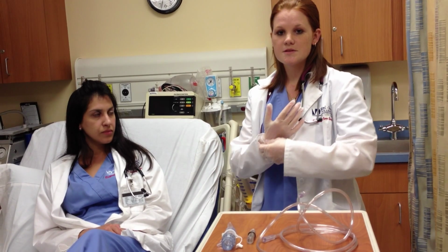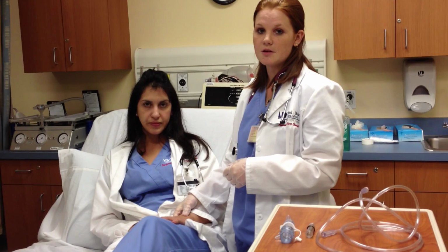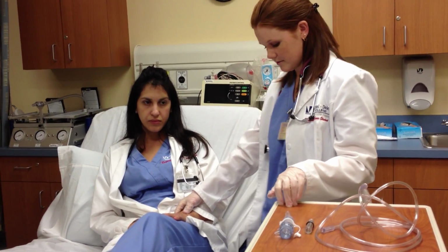Before I proceed with this procedure, I need to verify my patient. I look at her wristband, I check her name and her date of birth, and I compare it to the chart. If it matches, this is my correct patient. Then I'm going to do my pre-vital signs and breath sounds.